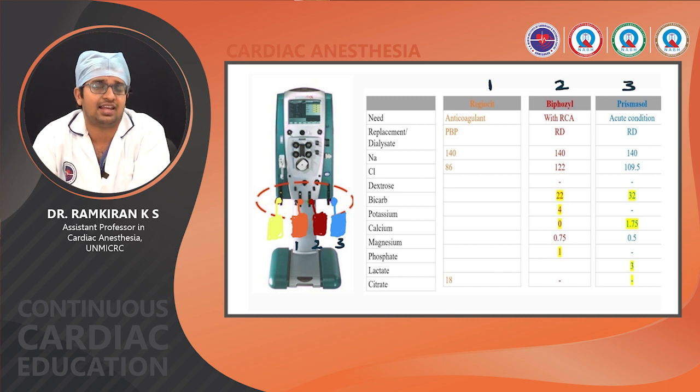And the second one is the dialysate, it is bicarbonate-based. So here it contains the various electrolytes as described. And the third fluid, coded in blue, is usually the post-filter replacement fluid. So it also contains sodium, chloride, dextrose, and it basically contains a higher concentration of calcium, because of the citrate which we use, the calcium levels which we target immediately post filter. Based on this replacement fluid, we can bring it back to normal levels. So other contents such as magnesium and so on are also used.